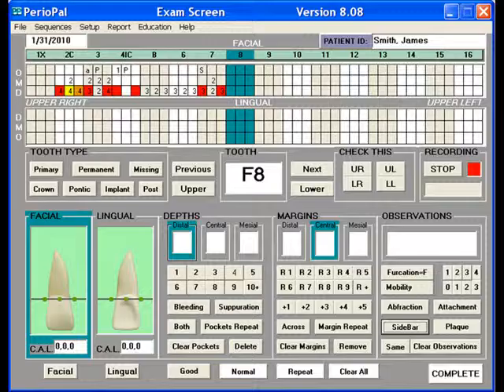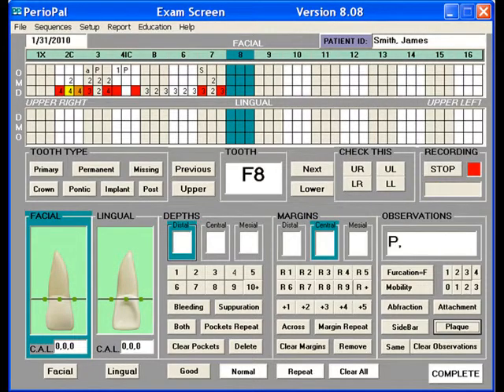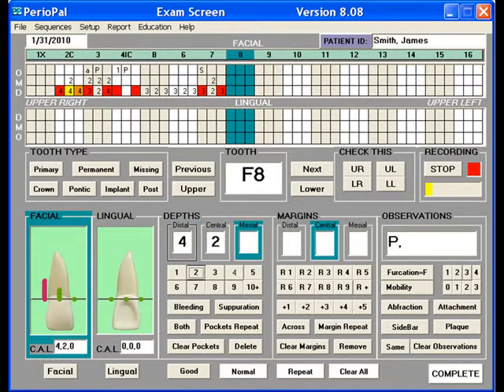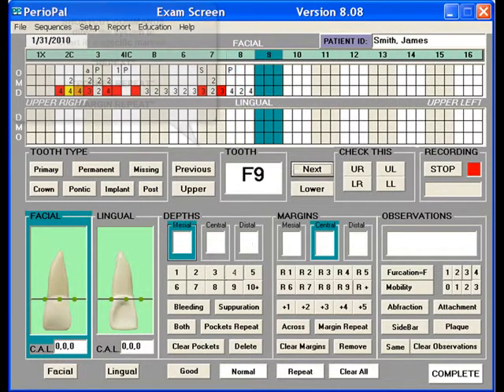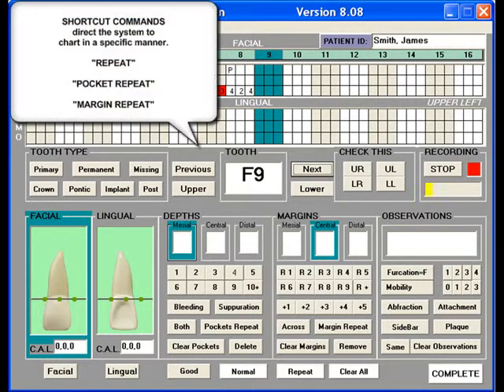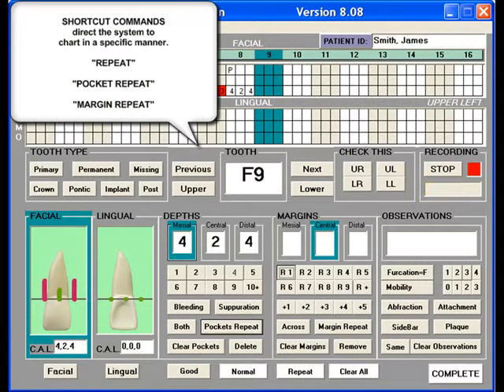Next. Plaque. 4, 2, 4. Next. Pocket repeat. R1. Plaque. Next.